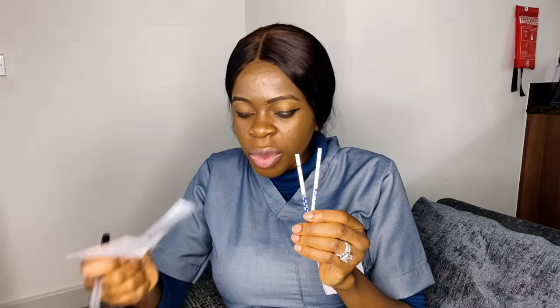So if you go home, just buy this. It's very, very cheap depending on where you are. It's cheap generally. So you can actually do your home test and find out. Even if you go to the lab, what they normally do is take your blood sample. What they are detecting from your blood sample is HCG, which is human chorionic gonadotropin. It's the same thing they are trying to detect from your urine.